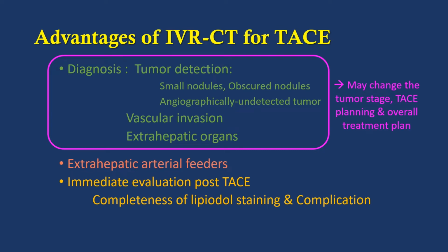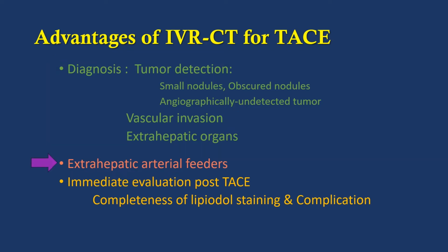The next advantage of IVR-CT is when you perform extrahepatic arterial feeder embolization. IVR-CT can help you identify an unusual branch of feeding arteries. IVR-CT can also help you pick the proper position of the microcatheter tip to avoid non-target embolization and also maximize the tumor control effect.